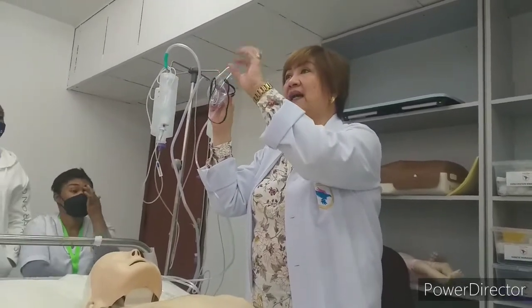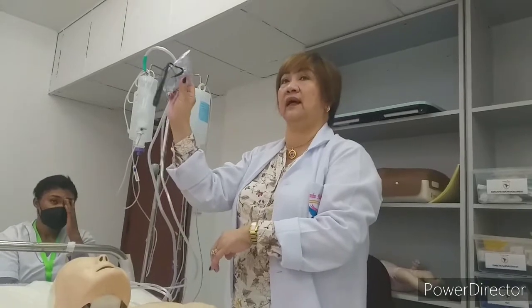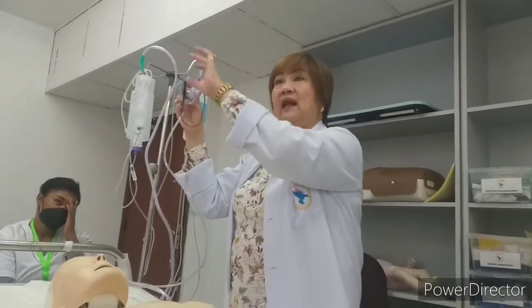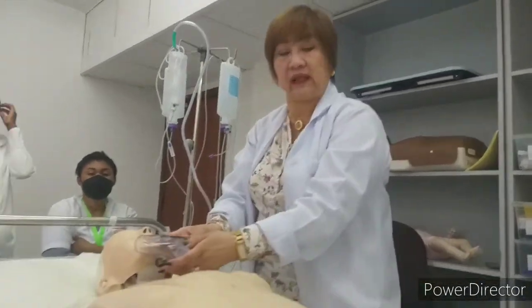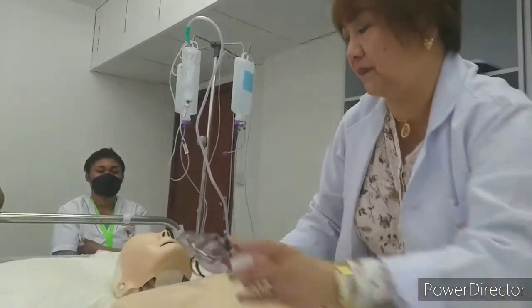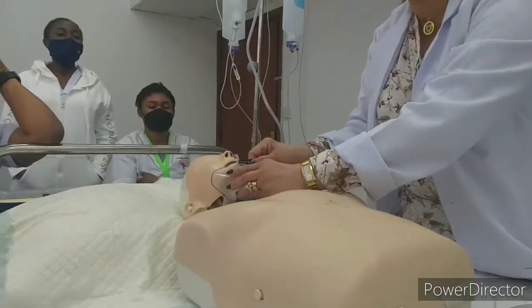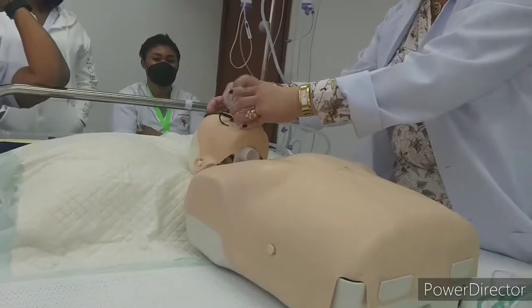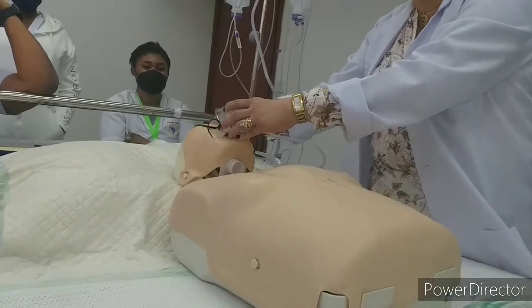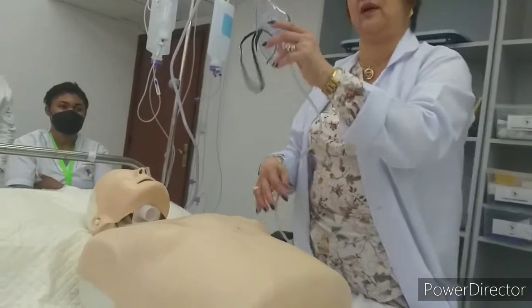Mist is something like a droplet coming out from this. Okay, just check it like this. Do not do like this. Okay, just check it and it will be functioning. Okay, that's the time. Same thing. Put it to the mask, to the trachea. Okay, covering the trachea tube and to the chin, or else to the nose, from the chin to the nasal bone, or we will not be using the nasal prong. Okay, so only these two.